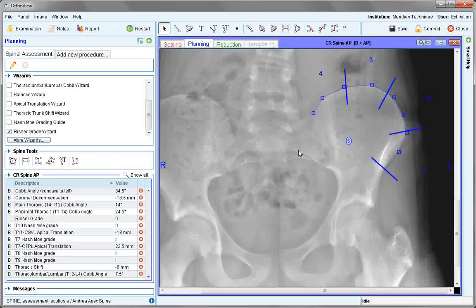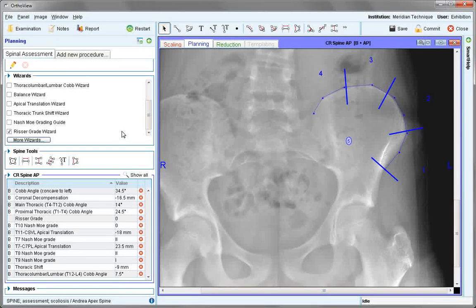This ends the spinal wizard set for the AP spine and it can be saved or committed. Depending on which wizards are visible when the save or commit is done, these will then be shown in the saved image.